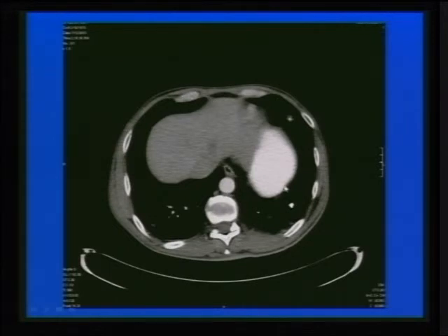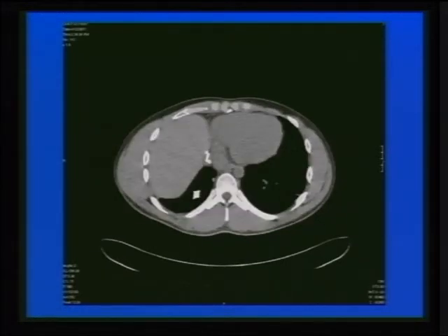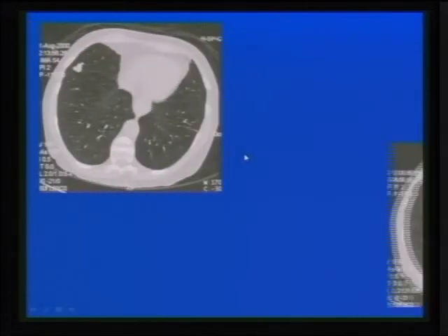Here's not a case where there's diffuse calcification, but in the right setting, this is going to be malignant, and this is a patient with osteosarcoma. So osteosarcomas, chondrosarcomas, synovial sarcomas, because they're bone-forming tumors, when they metastasize, whether in the lymph nodes or within the pulmonary nodules, they can be diffusely ossifying or forming cartilage. So in the right setting, calcification can also mean malignant disease. So this is ossification, if you want, of the pulmonary nodule. And you can see there is another deposit of metastatic calcification here and calcification within the lymph node. It doesn't mean always granulomas, another metastatic osteosarcoma.